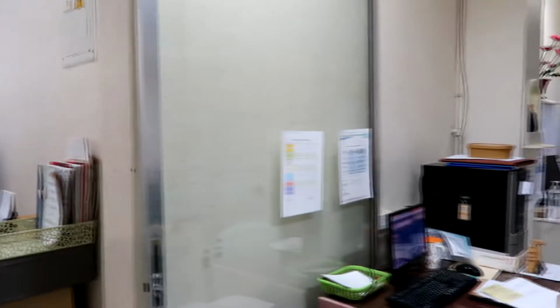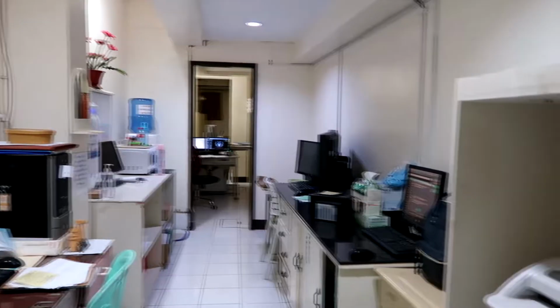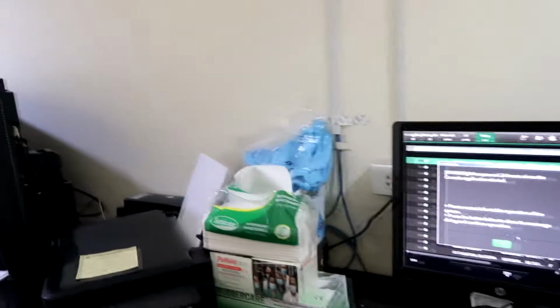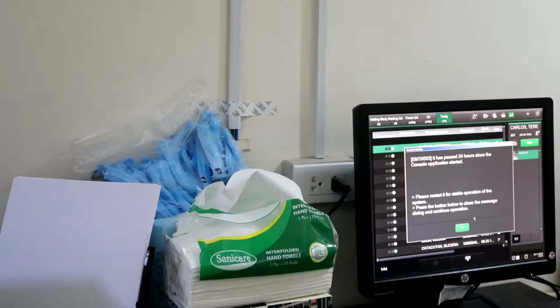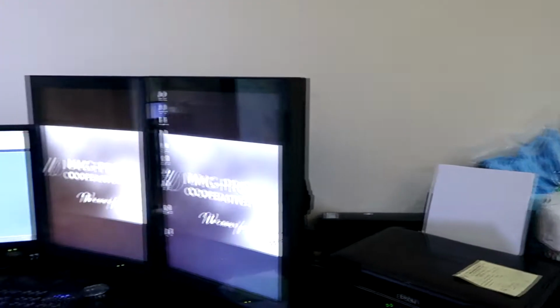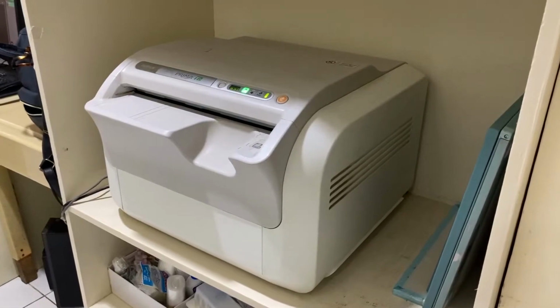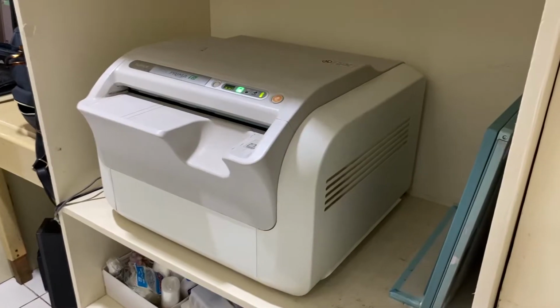The reading area is located next to the information. The DICOM images are being sent to the radiologist through Dropbox and RAMSoft. We also have portable X-rays and C-arm that are mainly used for admitted patients, especially for medical ICU, neonatal ICU, and isolation unit for COVID-positive patients. The PMMG MPC Radiology provides a high level of customer service to patients coming into the department and ensures they are timely taken back for their scheduled service.